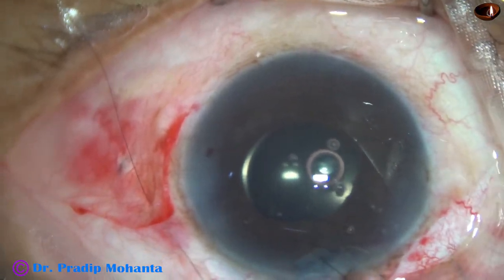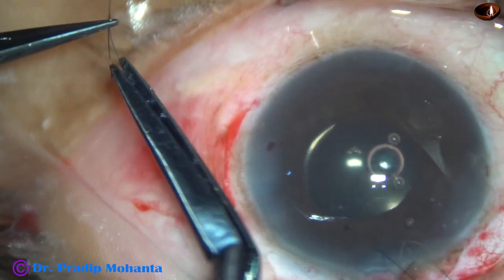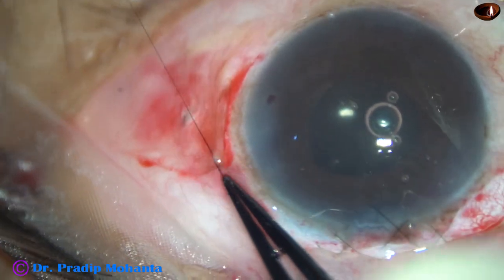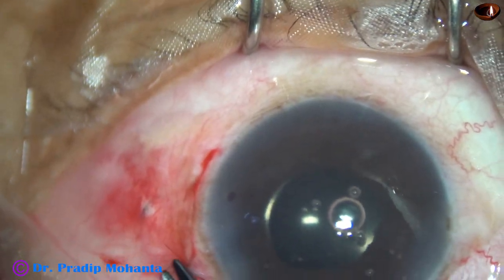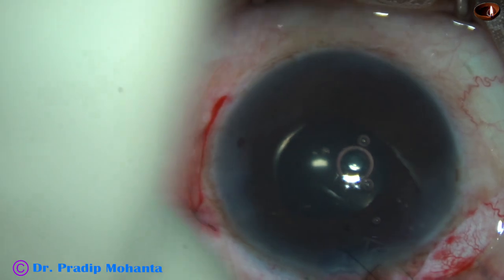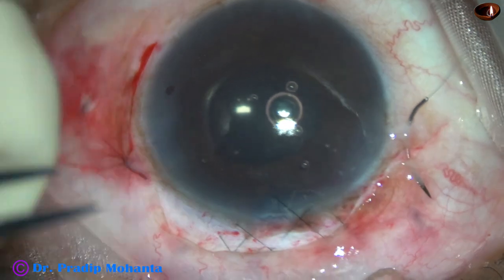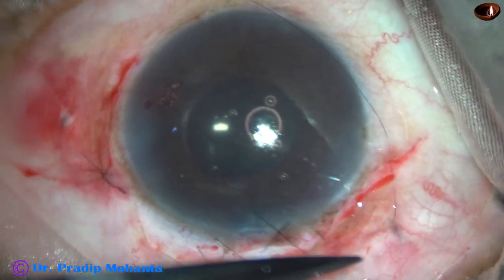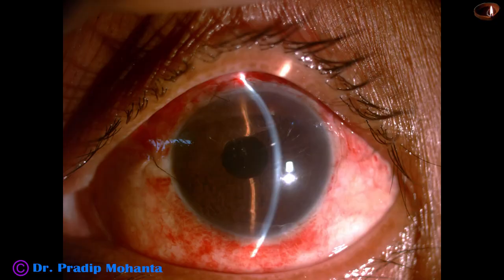These are the last stages of the surgery. The conjunctiva has been reposited. I had to close these sclerotomy wounds also with 9-0 Nylon. These are 10-0 Nylon releasable sutures to place the conjunctiva nicely at its original place. This is the last releasable suture. I used moxifloxacin intracamerally as the final step.